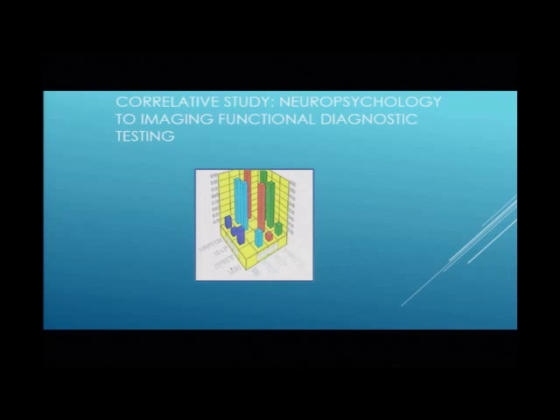We use that as the comparison. That's psychological testing to see if the brain is functioning or not functioning. We use that to compare the SPECT scan, which is in turquoise, and the evoked potentials and different quantitative EEG here. And when you look at this, here's the MRI. If you bring it down to neuropsych and see where they intersect, the MRI is abnormal in about 20%. That's pretty bad. And what that means is all this here, 80%, are normal.